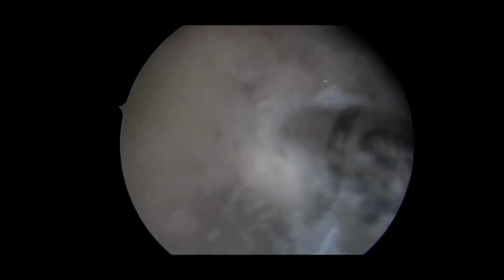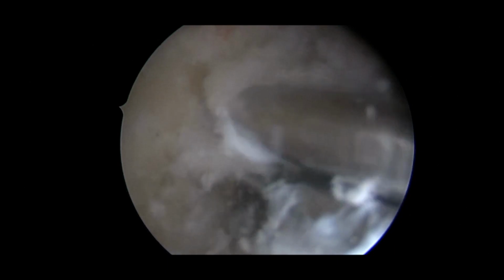Friends, this is an arthroscopic system. Now I am drilling my femoral tunnel through this drill guide. The length of this femoral tunnel is around 30 mm.